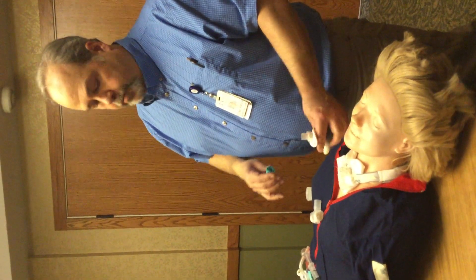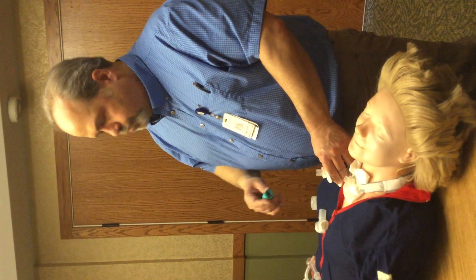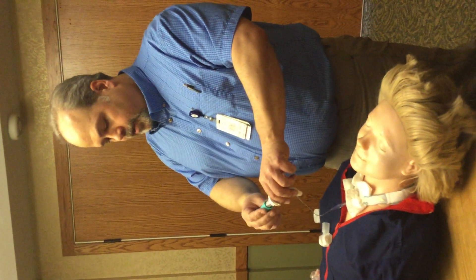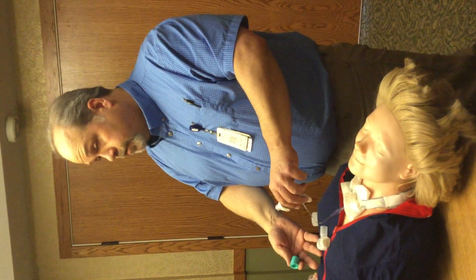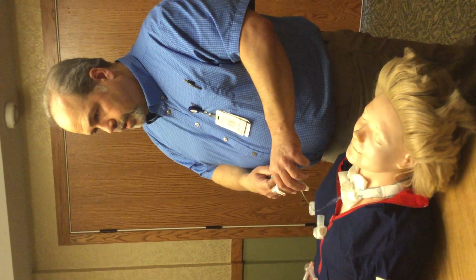You probably don't want to stand at the end of the bed either, because people will be watching when you're doing stuff with the tube, and if they're sitting up in bed it'll come right at them. When you pop that off, a lot of times they'll cough up a majority of what you need to suction, but there might still be some they need to clear down there.